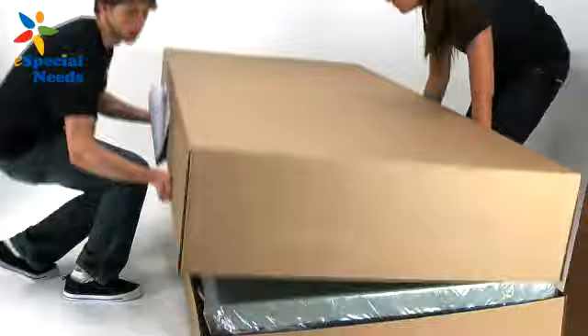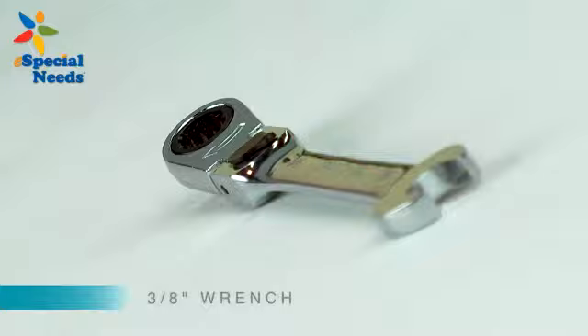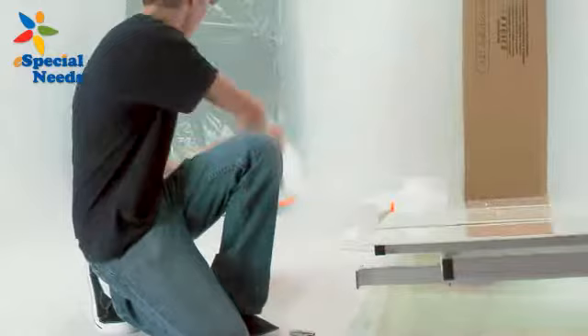To begin, carefully unpack all the contents of your bed. Everything necessary to assemble your bed is included in a special box marked 'additional parts inside,' which is located in the box containing the headboard and footboard. However, one additional tool you will need is one 3/8 inch wrench. Be sure to save the four foam shipping blocks used to package the electric frame, as they will be needed to aid in the assembly of your bed.